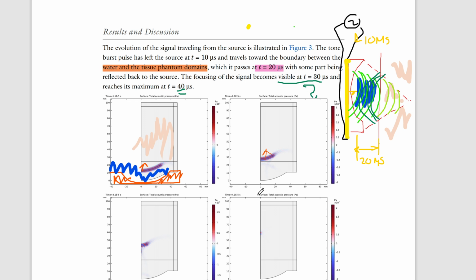Now it says the signal becomes visible. And I'm looking here because I almost want to say it has been visible because we can actually see it. So I don't know what they mean by it becoming visible, but as we look at this area here on the bottom, here's our reflections. Looks like I want to call this a reflection too, but I don't want to call this a reflection. I see a weird shape going here because this side's going like this, this side's going like this. This could be the reflection coming back upwards off of this boundary. Superposition could be something else. Not too clear.